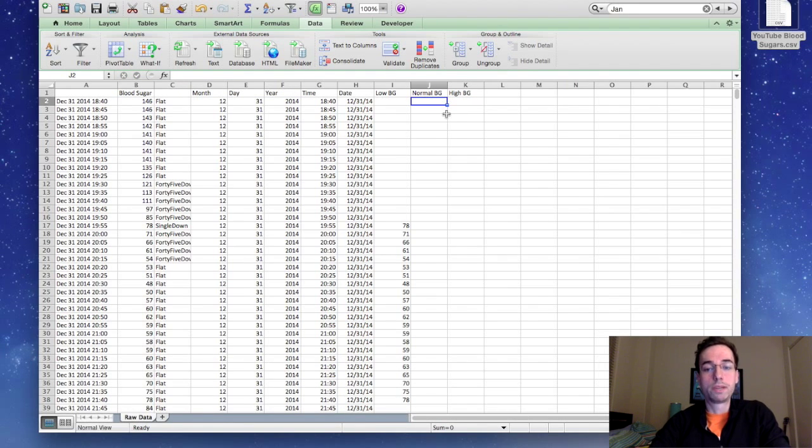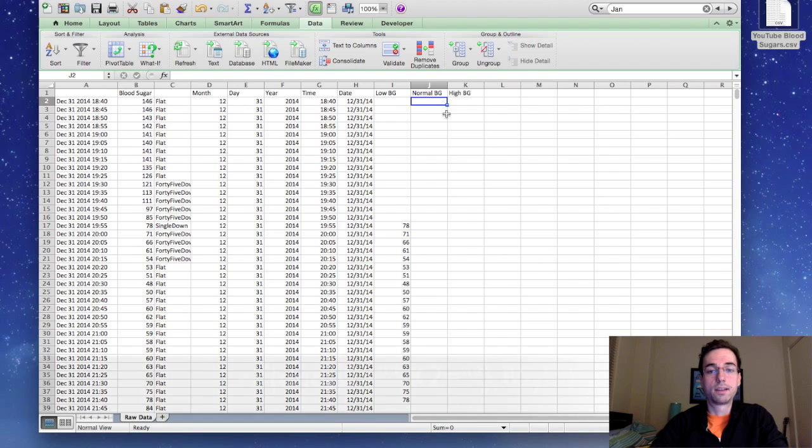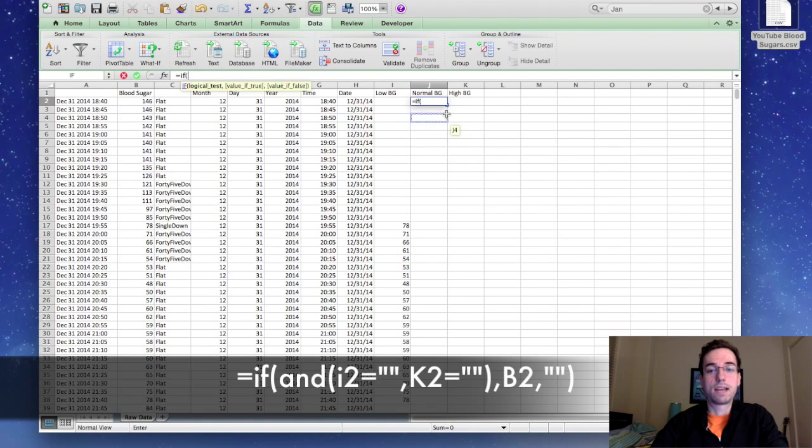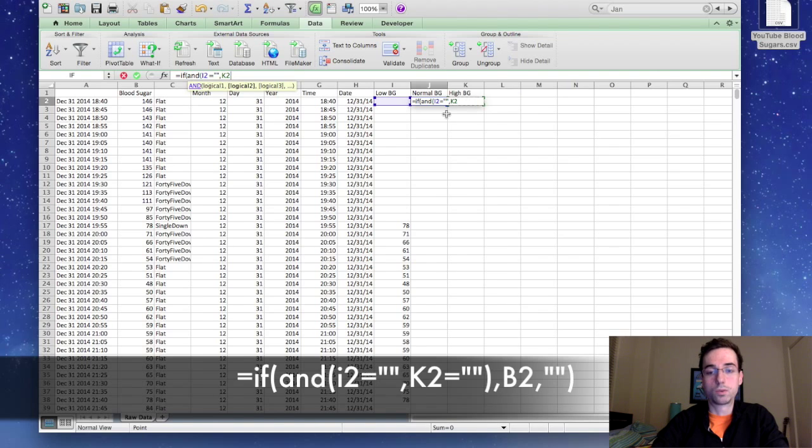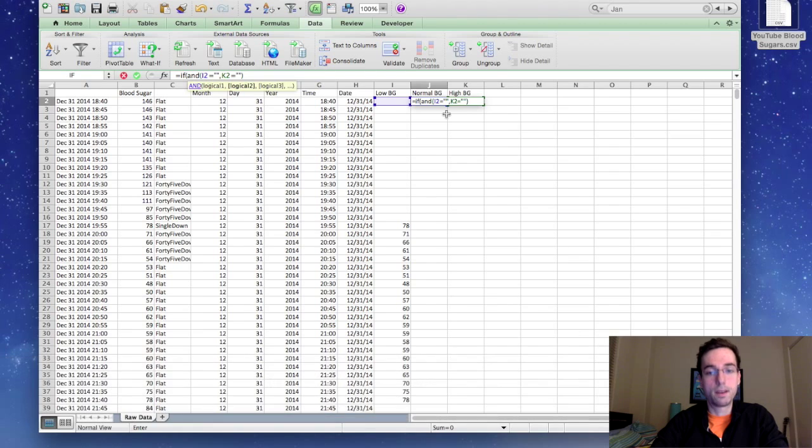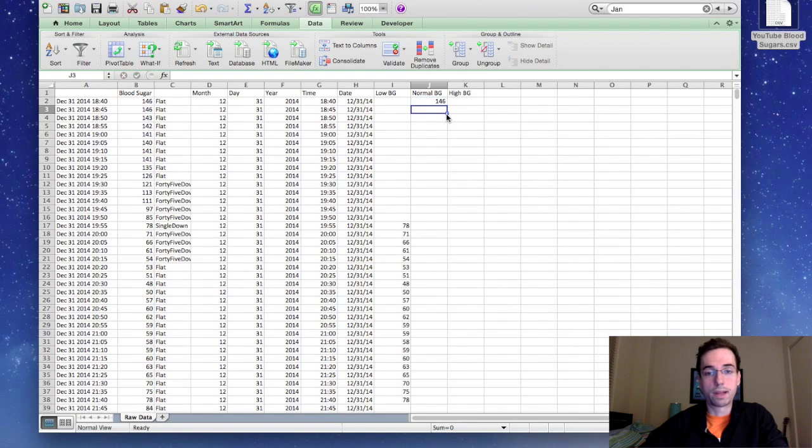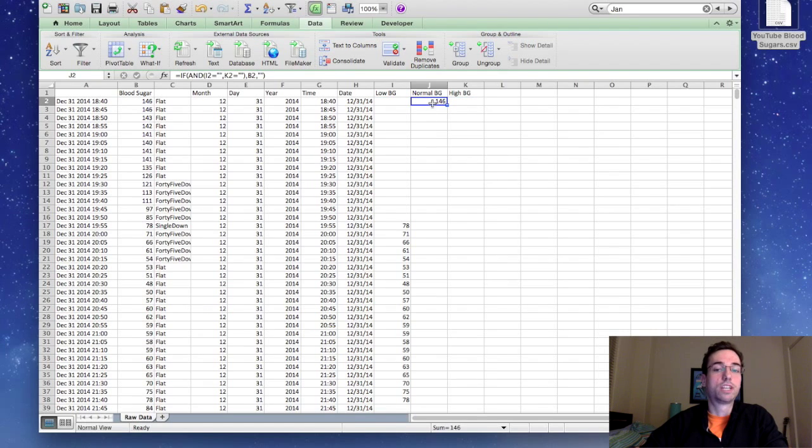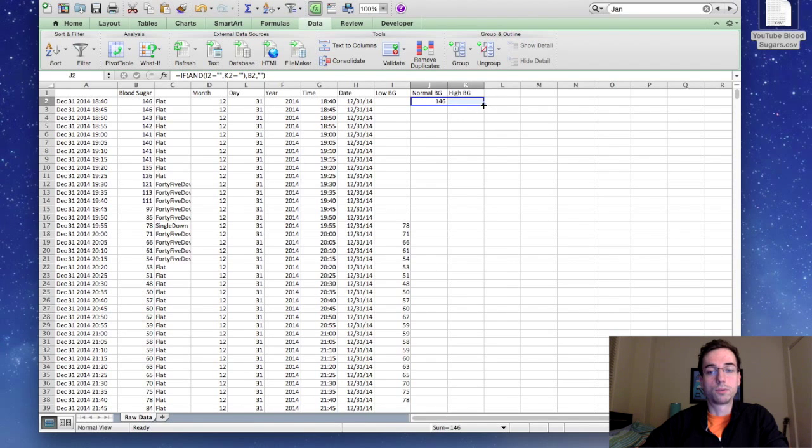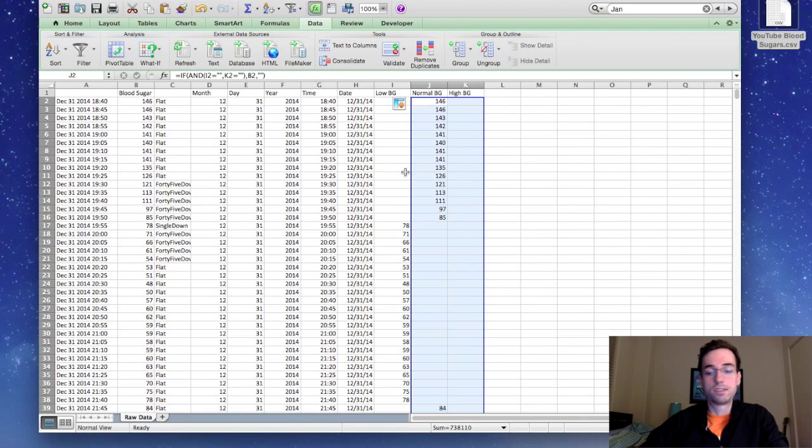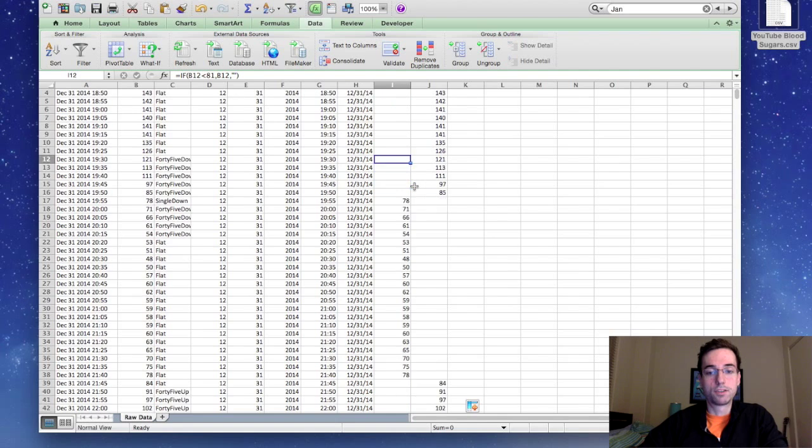Now we're going to go to normal BG, and for normal BG, we're only going to input the data if the other two low and high are both blank. So we're going to say it's going to be if and this, the low BG value equals quotes, and K2 equals quotes. Then they're both blank. We're going to add B2. If not, they're just going to leave it blank. So because I2 and K2 are both blank, J2 is now populated. Okay, the last thing we're going to do here is we're going to highlight both of these columns, normal and high BG, and we'll drag them down. So you should see for every blood glucose value, there's only one column populated here, the low normal high, so you can see that.